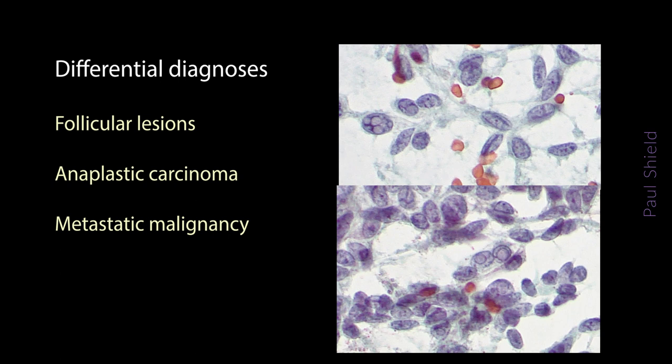Sometimes rosettes can be seen, and red cytoplasmic granules are sometimes seen on Romanowsky stains. INCIs are not a particularly typical finding of medullary carcinoma, but they've been reported in probably about 20% of cases. Some cases of medullary carcinoma can produce follicular structures cytologically and have rosettes clustering around amyloid, and they can also sometimes mimic thyroid papillary carcinoma, with intranuclear cytoplasmic inclusions being common like this one.